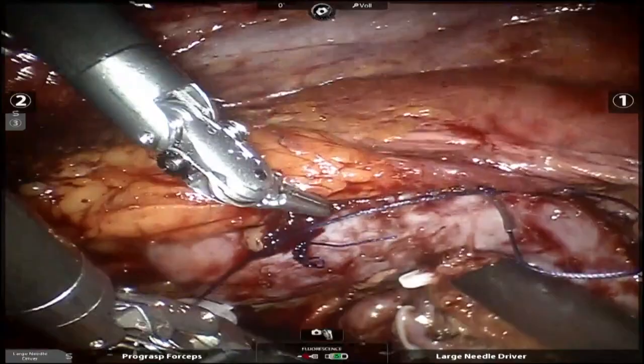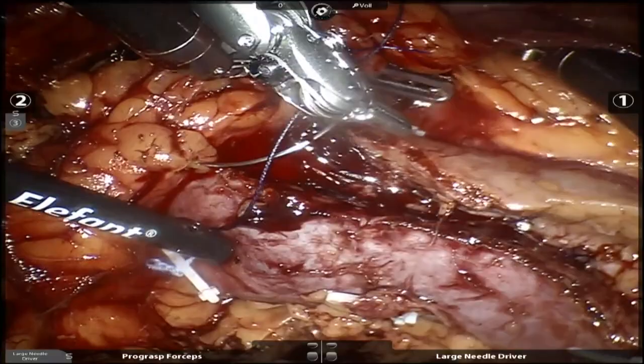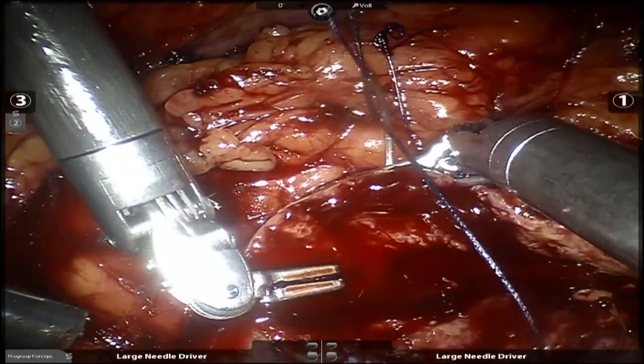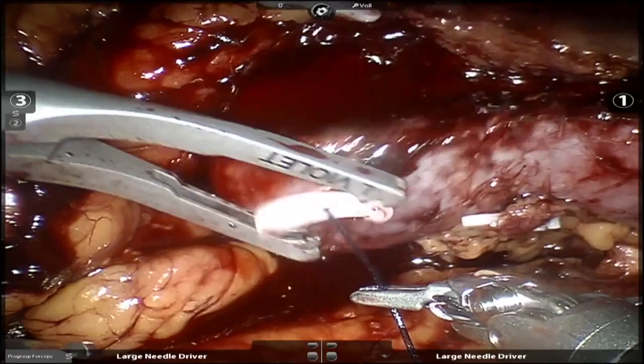All right, let's just see what we got here now. Okay, single. Let's have it. Okay. Yeah, but you see, it starts to bleed, so it was obviously a segmental artery. We took both clamps off. Go ahead, yep. I missed the main artery.